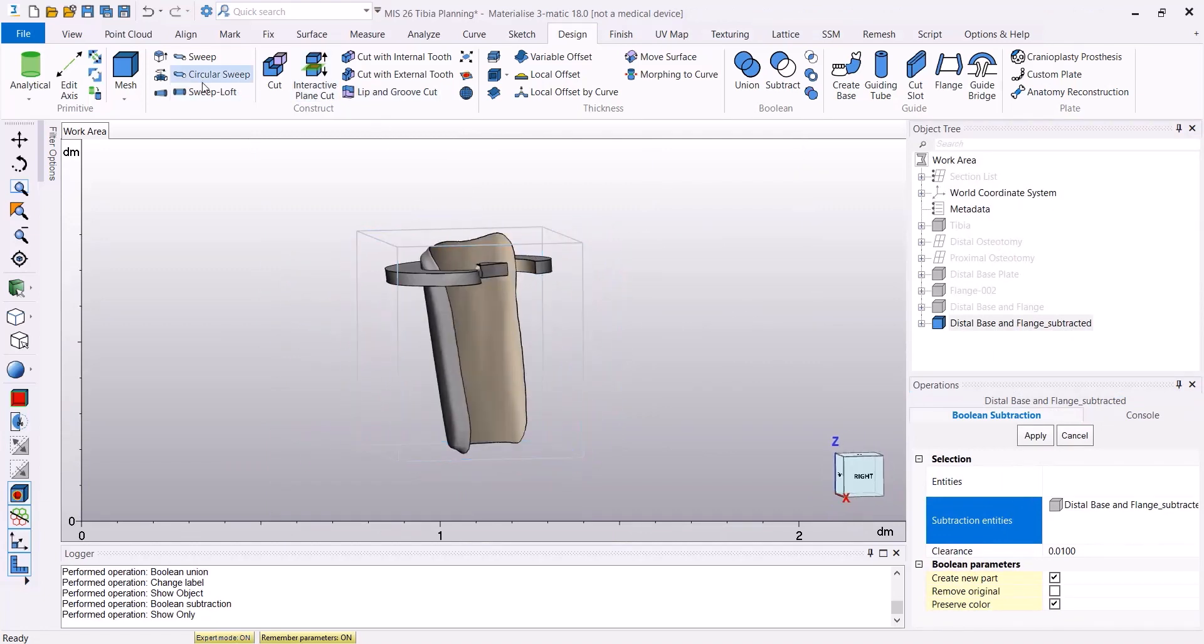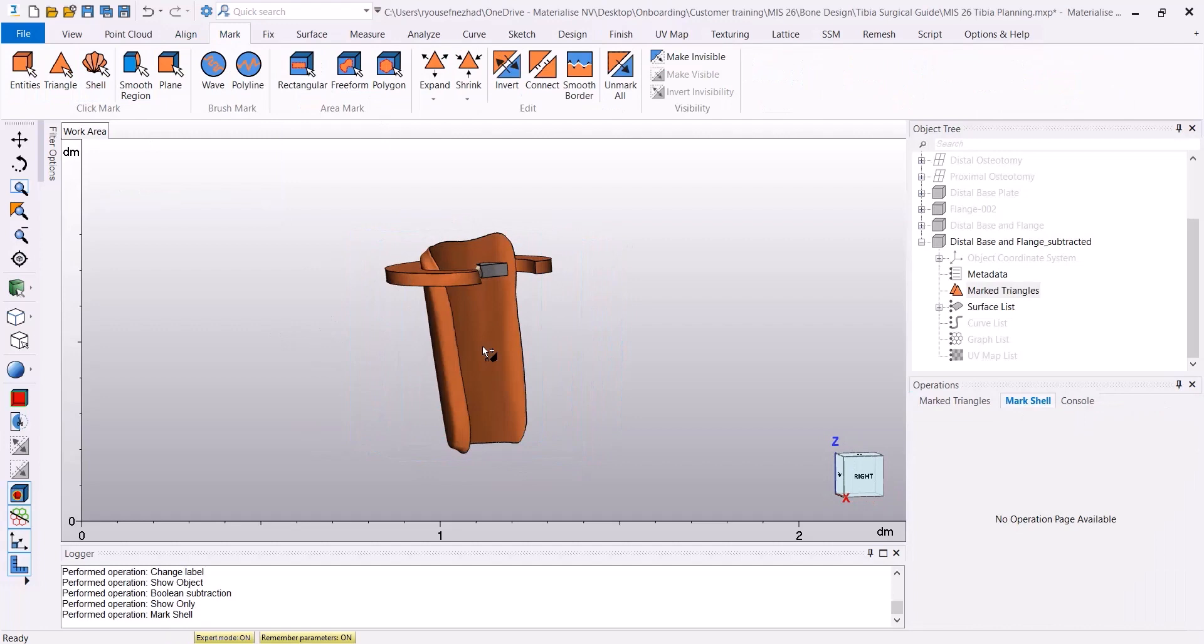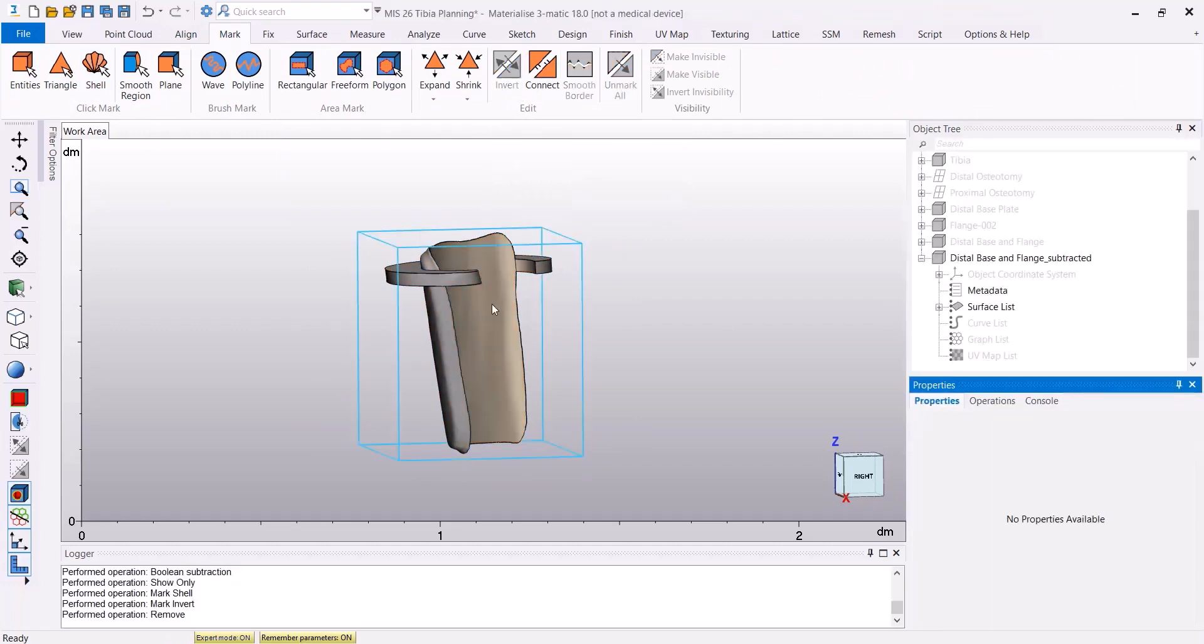It can happen that there are some parts which will not be of interest for us, which can be removed by marking them and then pressing Delete.